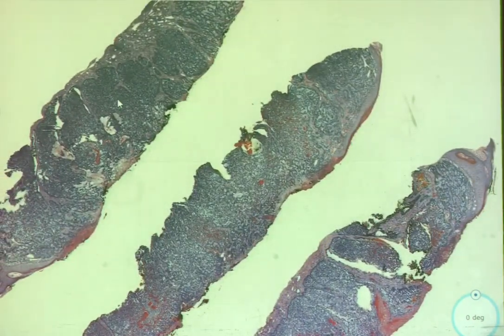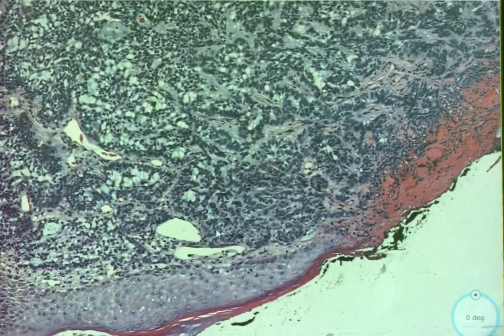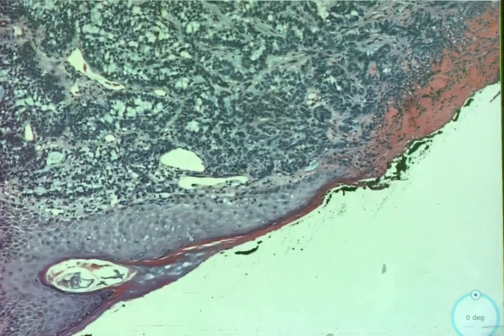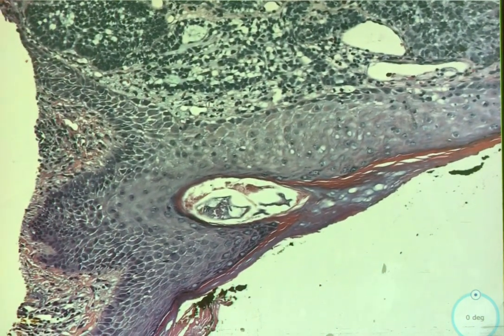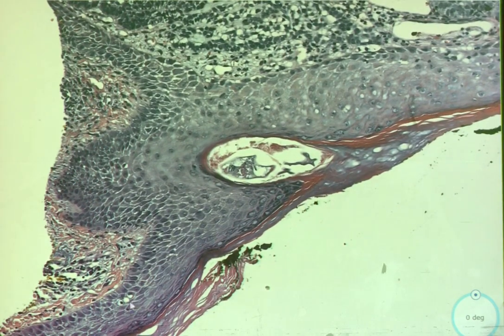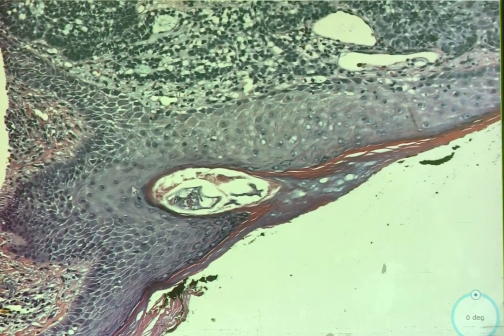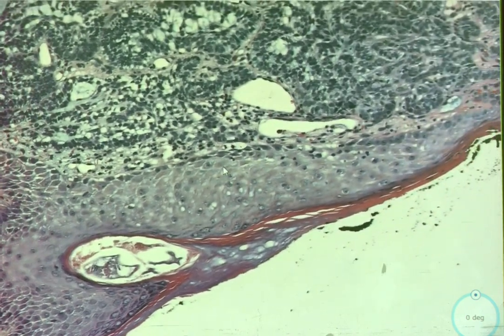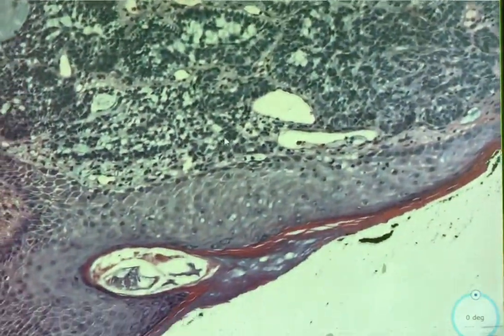And now it's the what's up, what's down, right? So I can help you out a little bit because this is up. This is up, yeah. That's epidermis. Spongiosis. There is spongiosis, yes. And this is tangential. So it makes it look deeper than it actually is. But okay. Are we worried about the epidermis? Not for the other parts. No, there's nothing other than the spongiosis. No. There's something, but I'll let it slide.